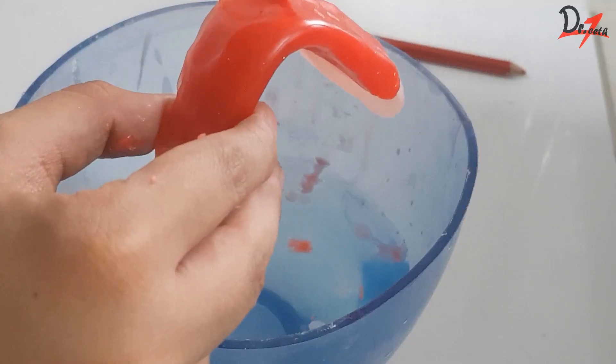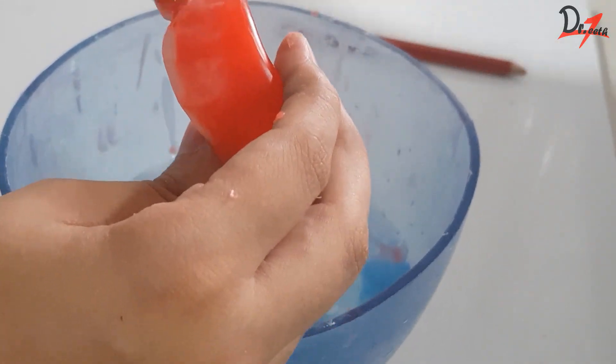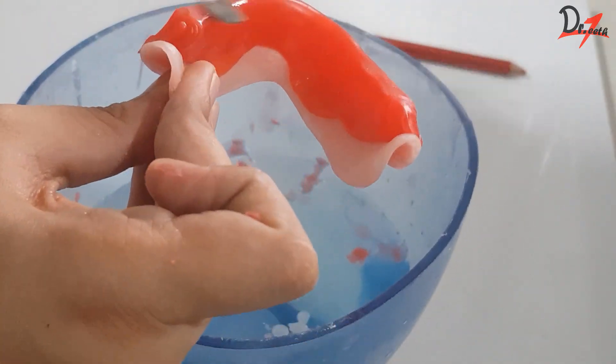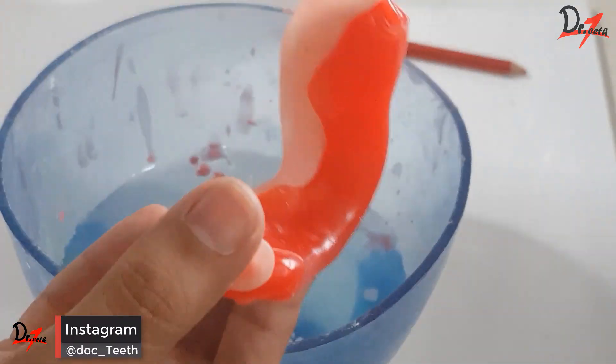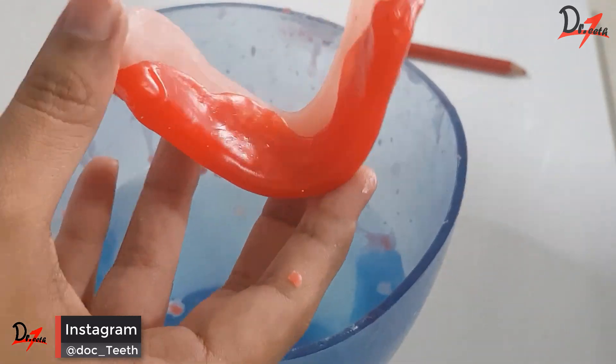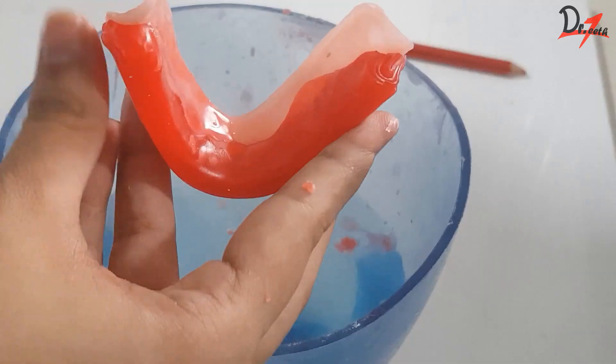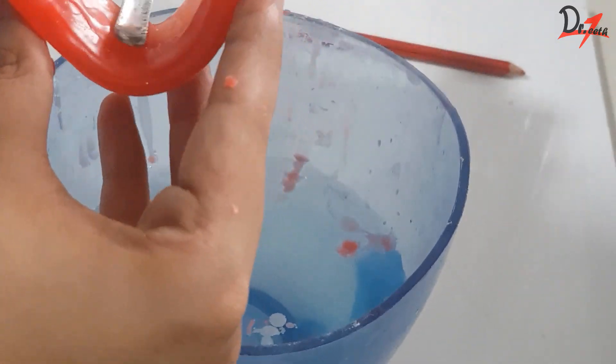You can always add more modeling wax wherever you find deficiency. Just make sure that you have to heat both surfaces — you have to heat the sheet and you have to heat your rim as well, so that they fuse together properly and there is no air entrapment in between.